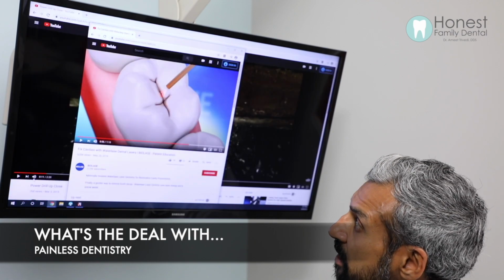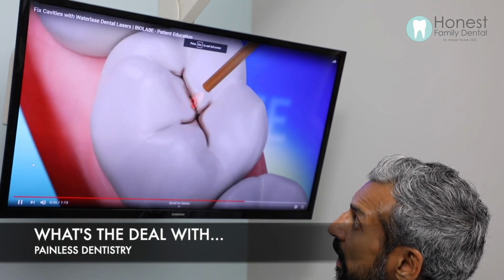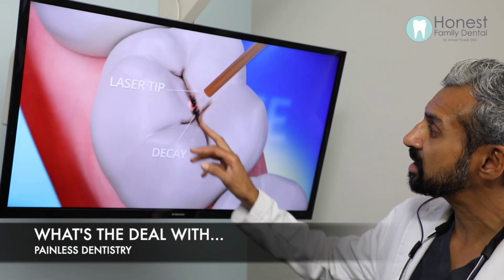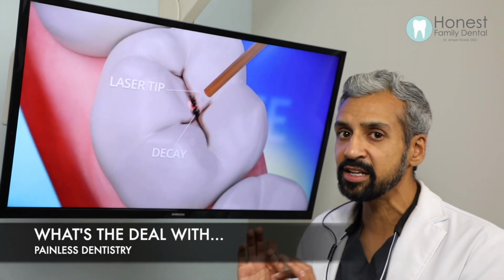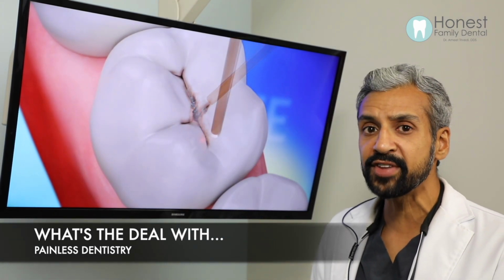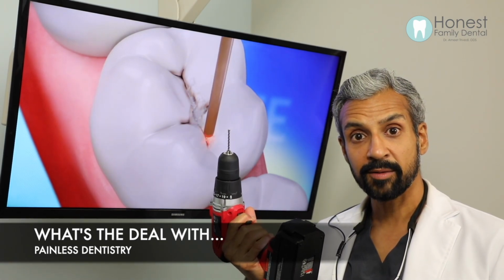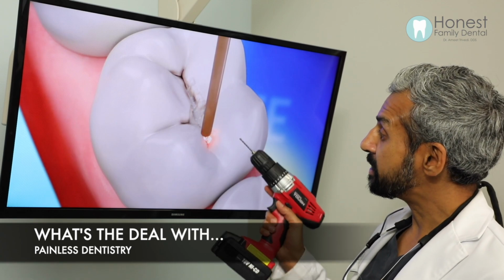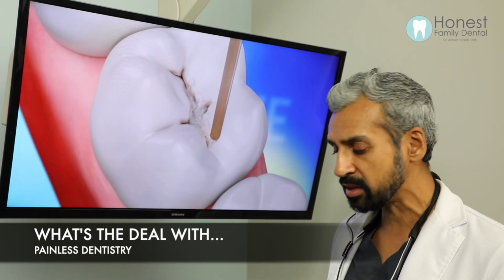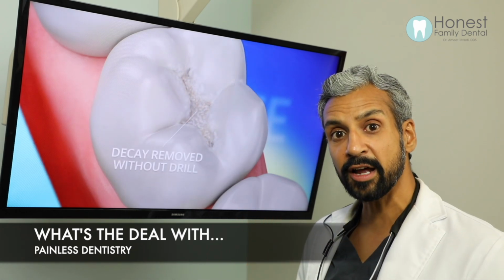We take a laser, we point it at the decay of the tooth, and it fires, vaporizing just the decay. That's the important part: it's hitting just the decay, because the laser is tuned to only affect the decayed parts of the enamel, whereas the drill takes out the healthy part of the enamel and the decay. It cannot tell the difference between the two. Lasers can distinguish between healthy tooth and unhealthy tooth.